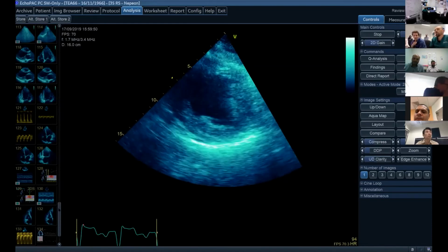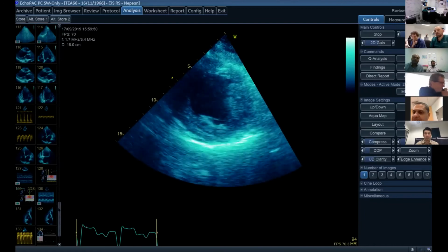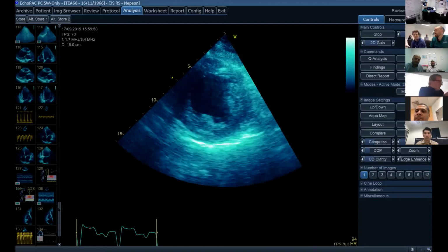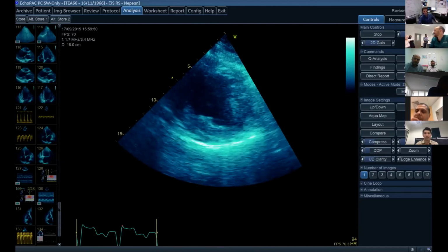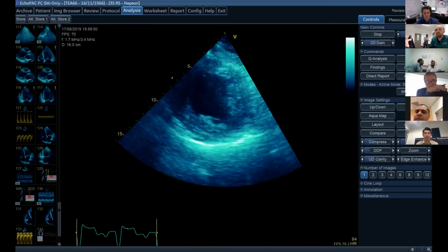Were there any final comments or suggestions from anyone? Quick question, Sam. The wall thickening of 50%, I'm just looking at Benita Anderson's book and she's saying 40. Oh, excuse me. I'm just using the ASE guidelines. Perhaps it's changed. Let me share and I'll check. Let me quickly bring back my screen. Pretty sure it's 50 in the ASE guideline.